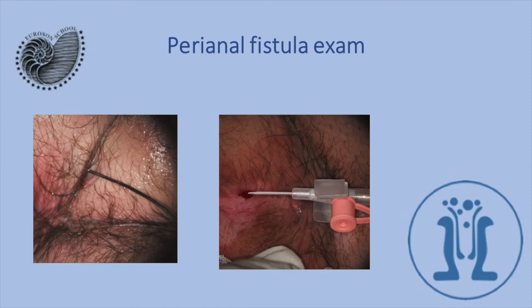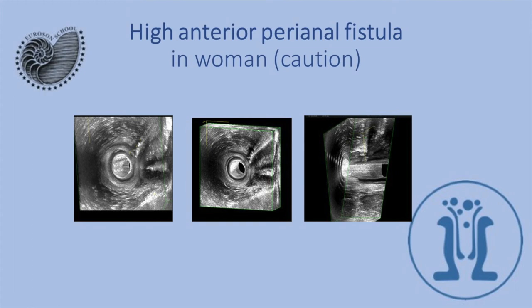Here we see a high anterior fistula in a woman examined vaginally. Here is the fistula in the anterior position, and here is the posterior position — here is the fistula. It is a very dangerous fistula: if we use the common operation of laying open the fistula, this woman would be left with very severe fecal incontinence.